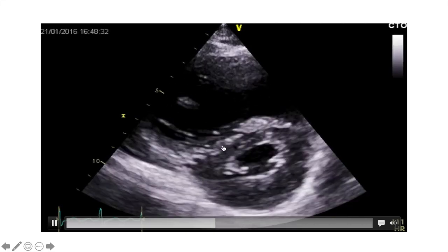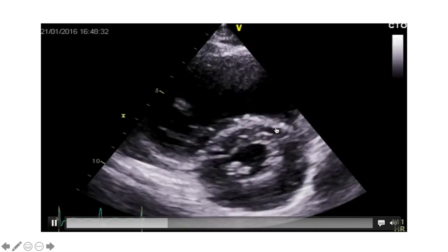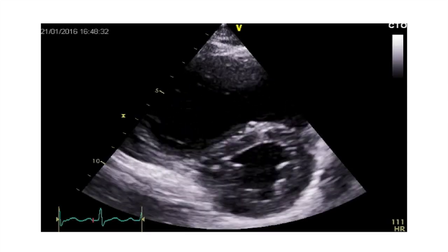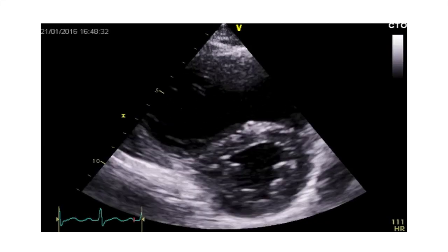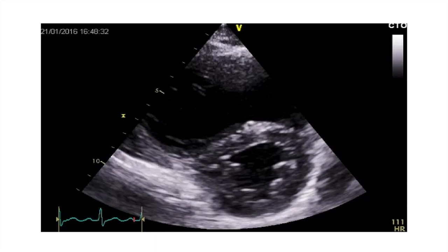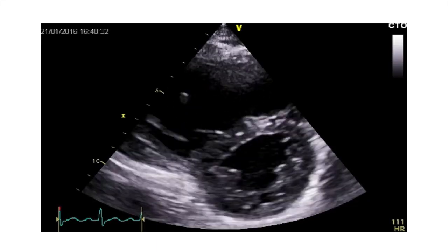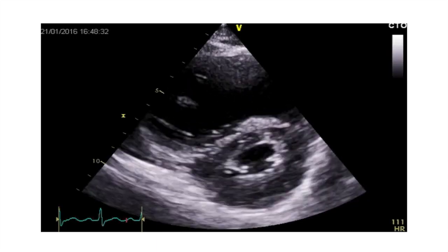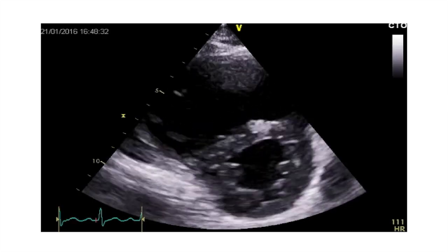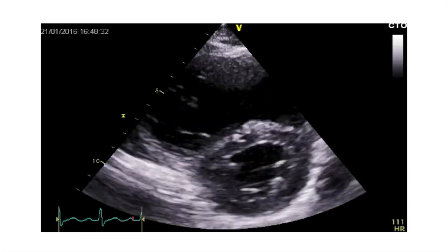You see the intraventricular septum looks abnormal. It's moving abnormally. And during systole, when the ventricle is contracting, it flattens. And this is the D-shaped ventricle. If the flattening occurs during systole, it's an acute pressure overloaded system. So classically this occurs with PE, but you can also induce it with a very good ventilator recruitment maneuver and other pathologies as well.